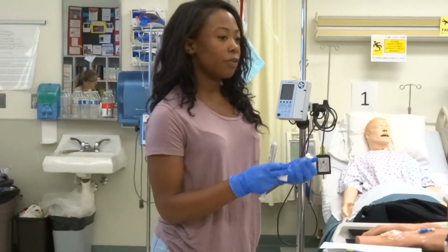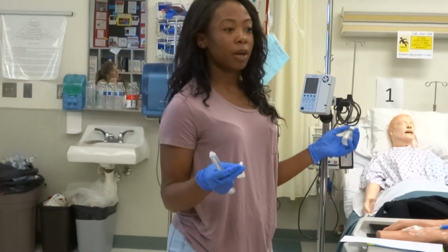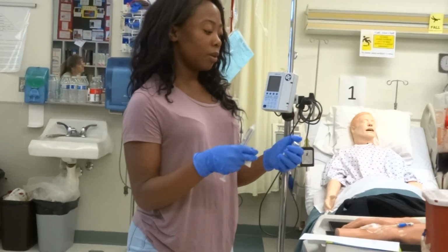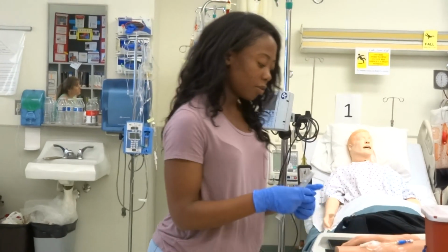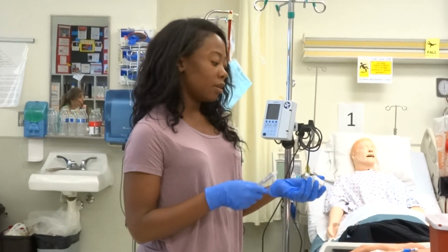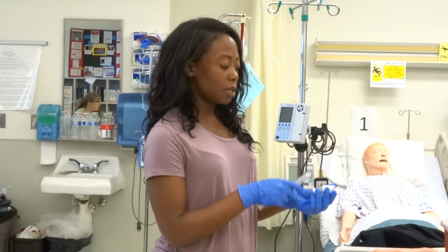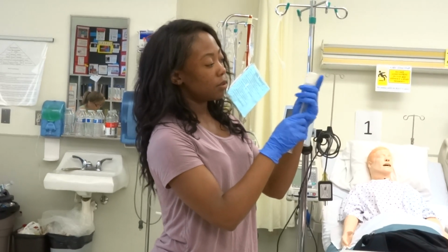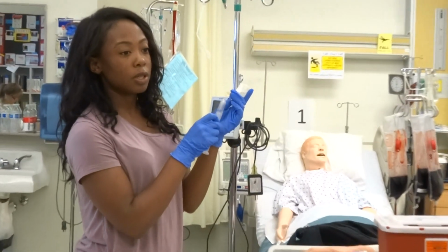But for Protonix, if it's new, meaning the cap has not been popped off, which it shouldn't be, it should come out of the Pyxis or the Omnicell, it's fine to just go ahead and do it. But if you want to be evidence-based, just scrub that for maybe 10 seconds. Push all the contents inside of this bottle that contains the powder. You're going to swish it around a little bit, like that, and draw everything back out until you get the full 10 mLs again.